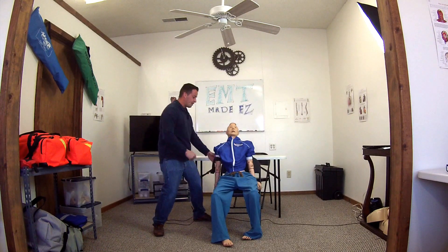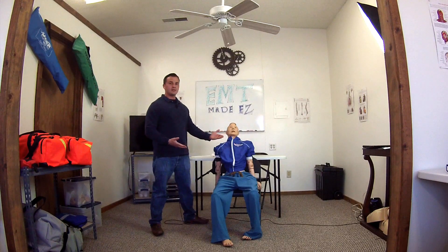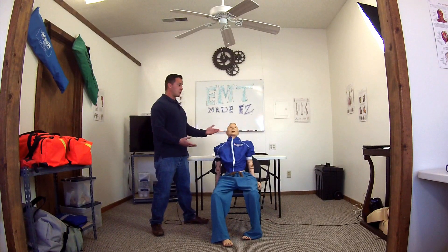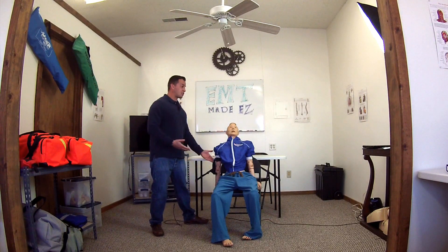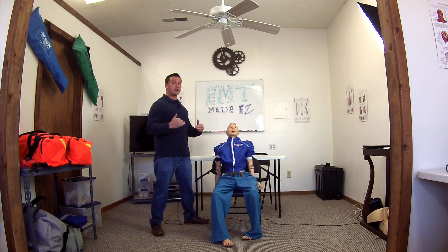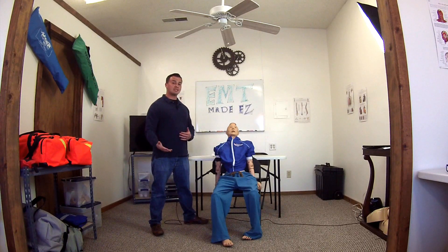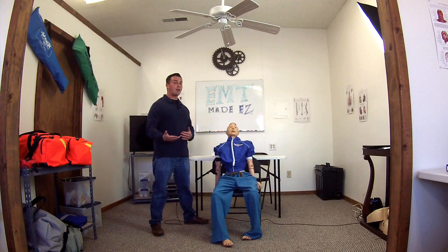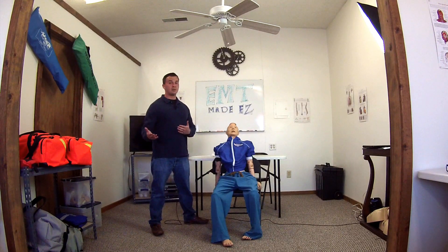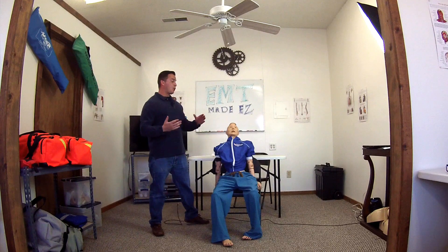My tourniquet is on — I'll go ahead and tighten it up. The tourniquet is good. Ask the proctor: does the tourniquet stop the bleeding? The proctor will say bleeding has stopped, but your patient is now showing signs of hypoperfusion, or they may say shock.